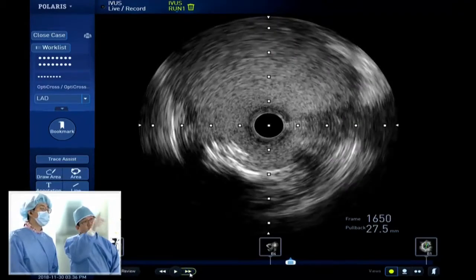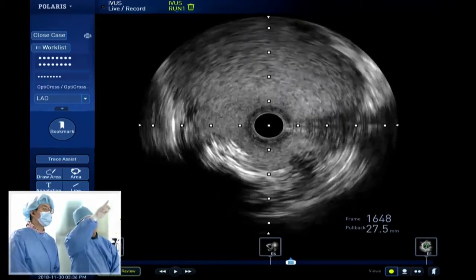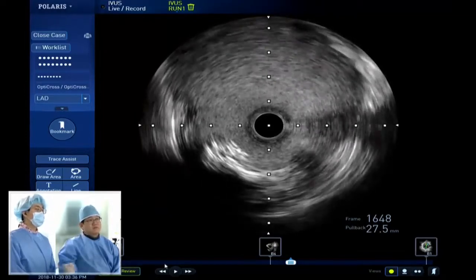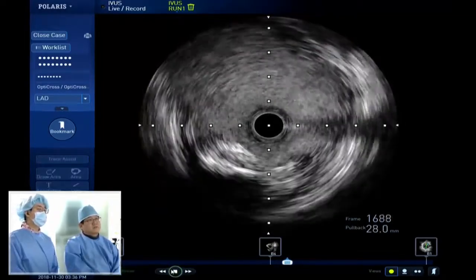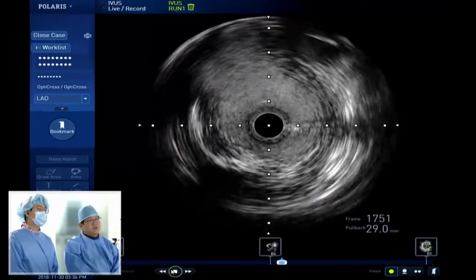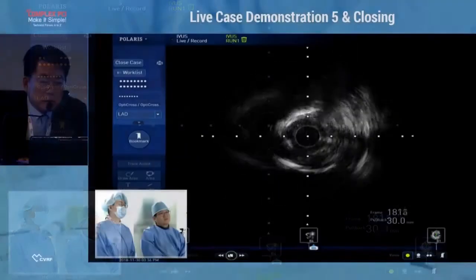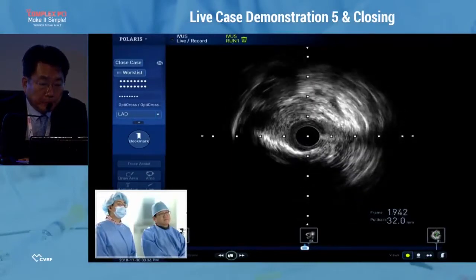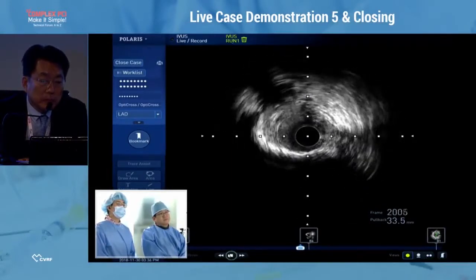This is the aneurysm. You can see the media around the aneurysm, so this is true aneurysmal change. Run, please. The opening base is very large, right? Yes, we didn't expect that one. So proximal is very tight, and diffuse disease.